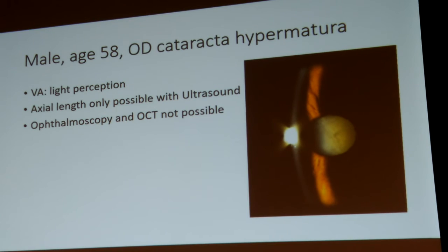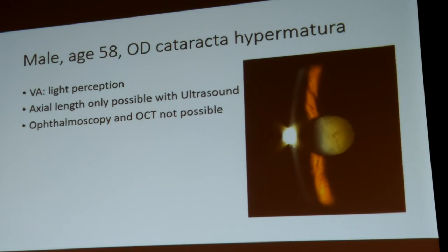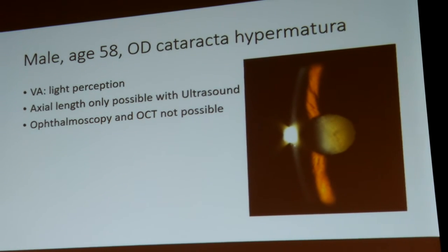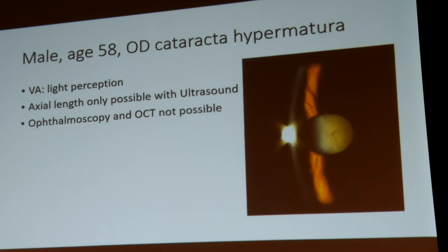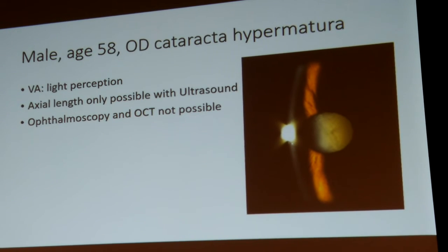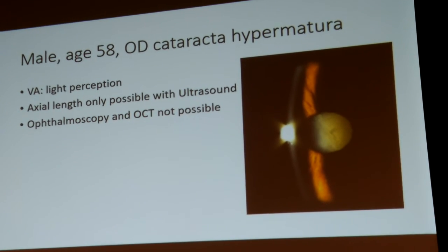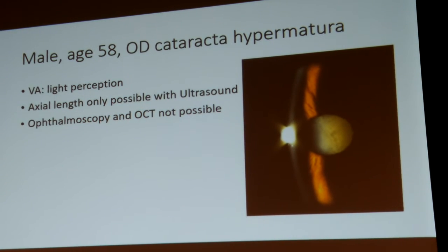So, and he is young. The other eye is 20/20. So he came and said, oh, but I would like to have a multifocal lens. We said, oh, with the ultrasound measurement, and we don't know how the retina looks, what shall we do? Shall we just use the measurement from the good eye and fit it in, then use that axial length and do the surgery based on that information? And if we don't nail the target, we do a laser refractive surgery.